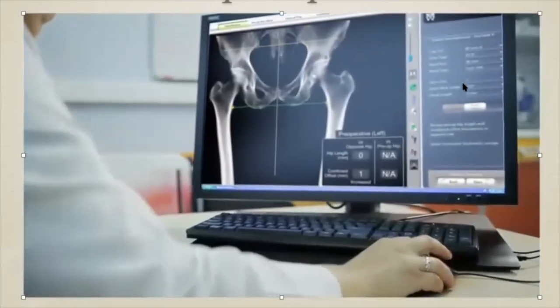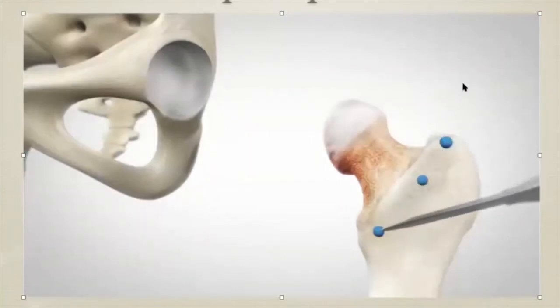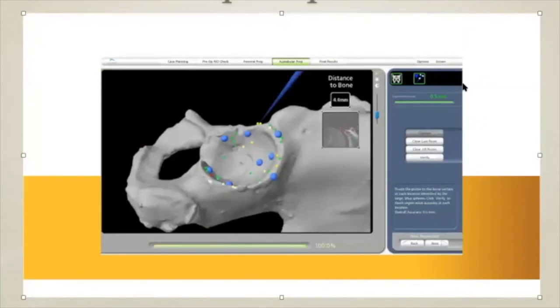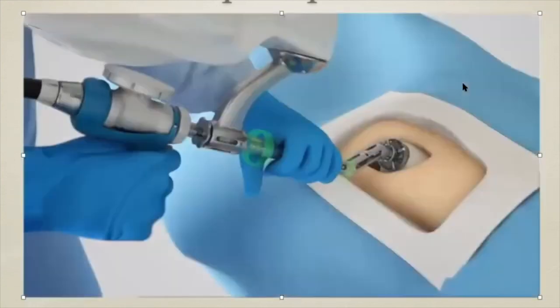And what that allows us to do is measure incredibly accurately the patient's pre-surgical position of the hip, leg length, offset, everything that we need to reconstitute. And so when we put the patient on the operating room table, we now have to register the patient's anatomy, i.e. telling the robot where things are in space. And we do that by this verification and registration process, which takes about 15 to maybe 30 minutes. And once we complete that registration process, now the robot knows exactly where the patient's anatomy is.